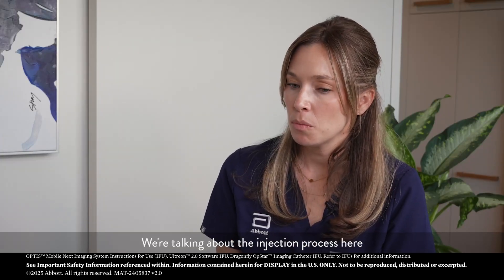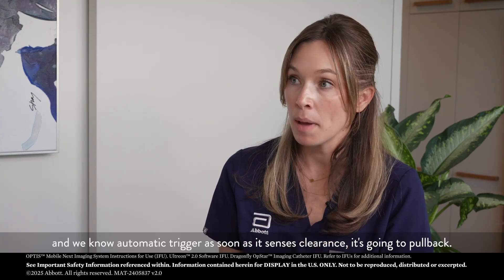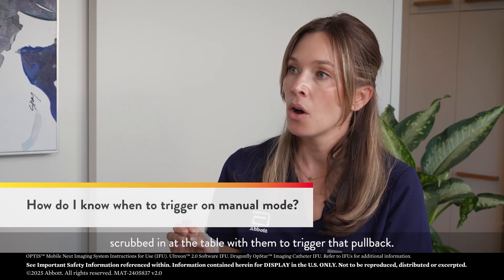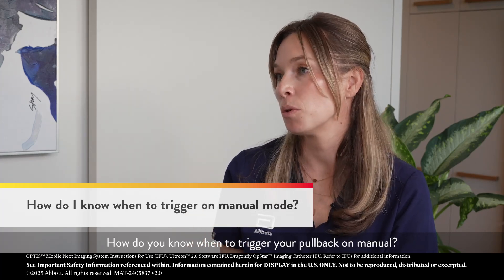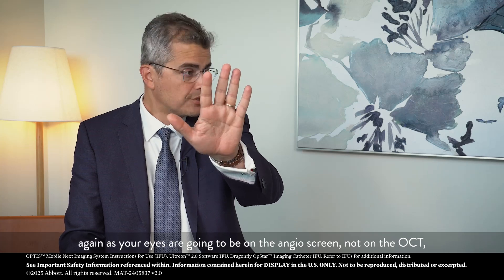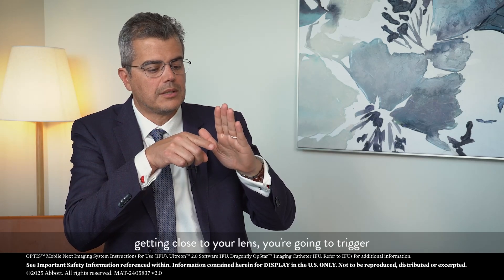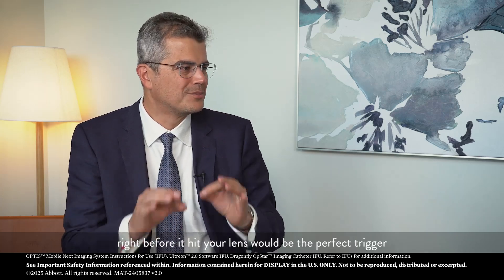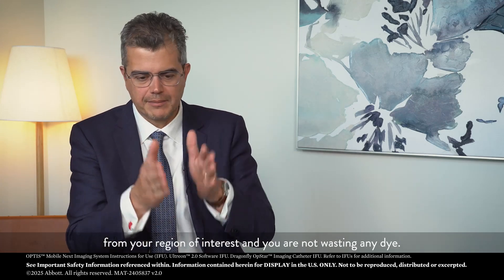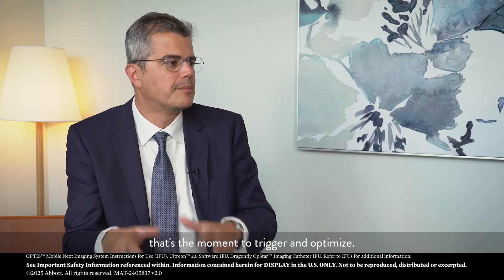Going back to the injection process — with automatic trigger, as soon as it senses clearance, it pulls back. But with manual trigger, that's up to the operator or whoever is scrubbed in at the table. How do you know when to trigger the pullback on manual? If you opt for manual mode, your eye is going to be on the angio screen, not on the OCT. As soon as you see that column of dye getting close to your lens, you trigger — right before it hits the lens is the perfect trigger moment.